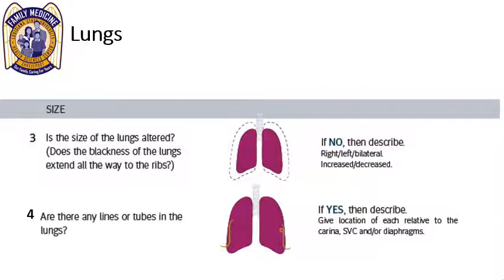In addition to that, it depends on what kind of pneumothorax or hemothorax you have. If you want to drain the hemothorax, then it may need to go up or down. So those are all instances where you're going to expand your knowledge if you don't already know. And knowing where those tubes are located is of utmost importance, especially if something's dislodged or the tube's not putting out any more output.